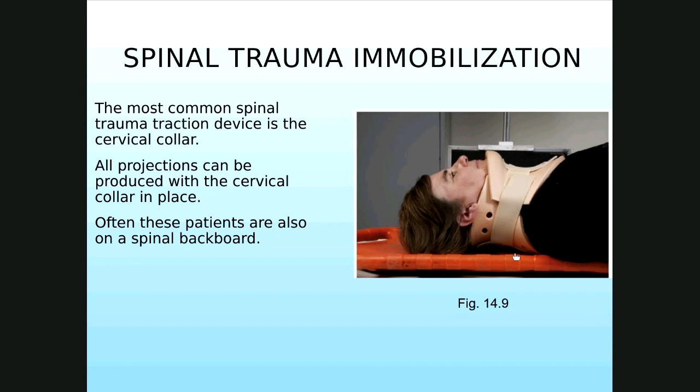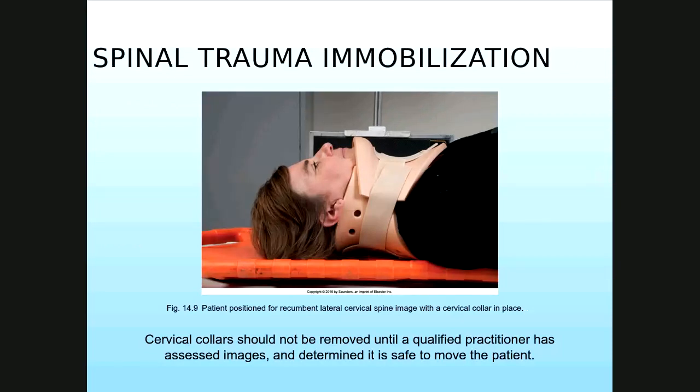This backboard or spine board is designed to immobilize not only the entire spine, the thoracic, lumbar, but also assists in immobilizing the pelvis and the lower extremities as well. Notice it says cervical collar should not be removed until a qualified practitioner assesses the images and determines it's safe to move the patient. And that qualified practitioner is either the radiologist, the attending physician, or a neurosurgeon. We are never allowed to clear films for cervical collar removal.